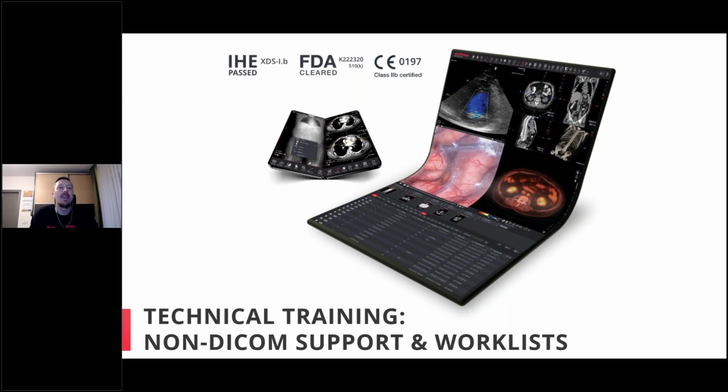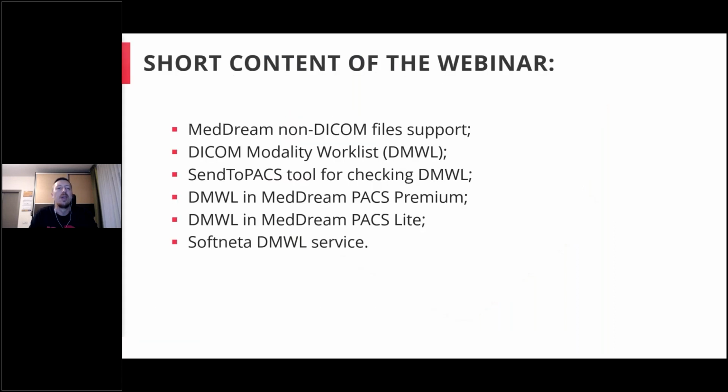So on today's webinar, we will talk about non-DICOM support and worklist. So let's jump through the agenda of the webinar. I will briefly present our new functionality of non-DICOM file support. It will be broader presented during our new version release, so it will be just a sneak peek of our new thing. And of course, our main topic, which a lot of people asked to have a webinar on, is Modality worklist. So we will talk about it.